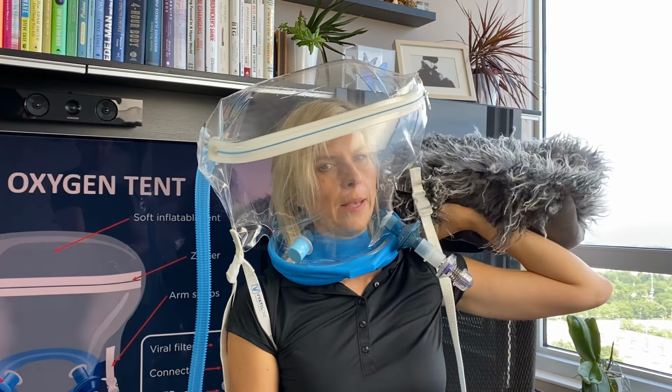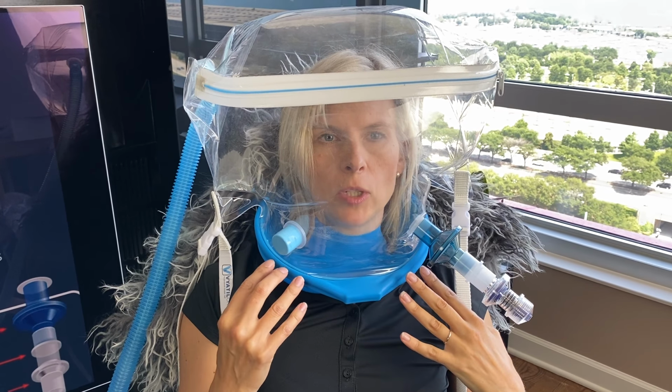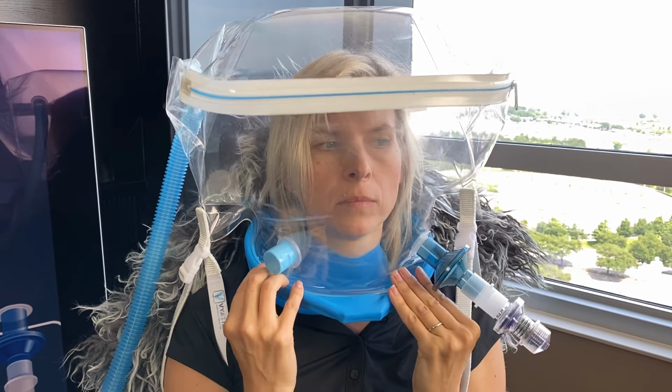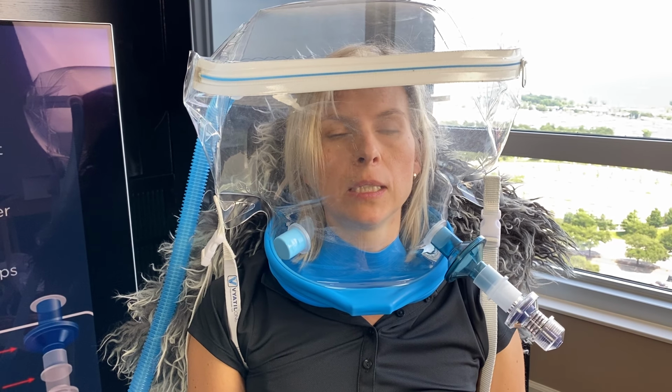And when we lay back, what is nice about this ring is that because it's smaller, it doesn't push the tent forward. This neck seal can be a little bit smaller for me. Just like I said, I have a small neck. So make sure that you order the smaller size for your patient, especially if you have a petite small lady or people with thin necks. They will need the small size because that's going to help to seal the leak.